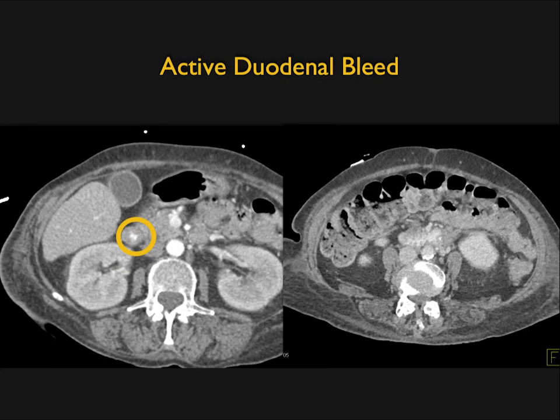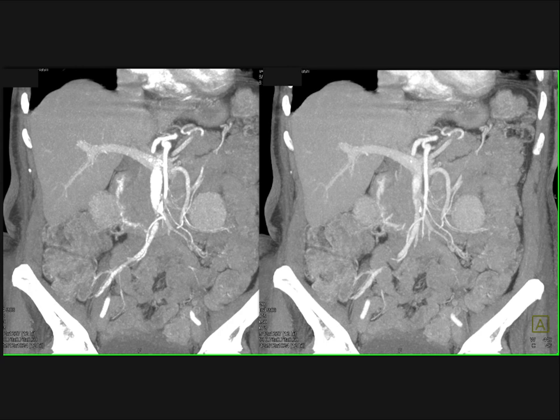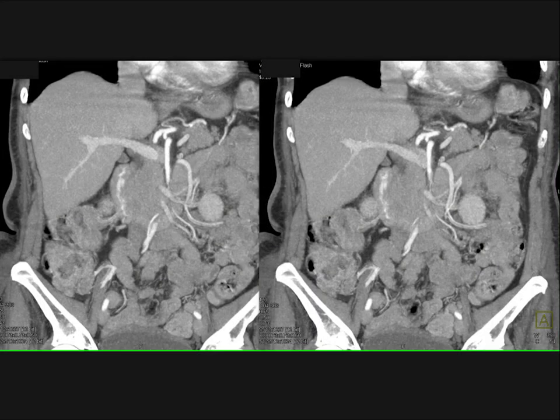When doing CT, you never want to use positive oral contrast — always use water. Here's a nice example: there's high density in the duodenum, which with positive contrast you might dismiss. But on the 3D MIP imaging you can see the SMA, celiac, portal vein, and SMV — and the entire duodenum has high-density material within it. That's active bleeding in the duodenum, very nicely demonstrated.